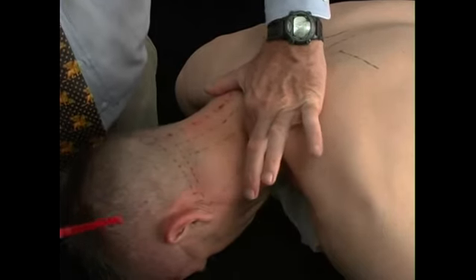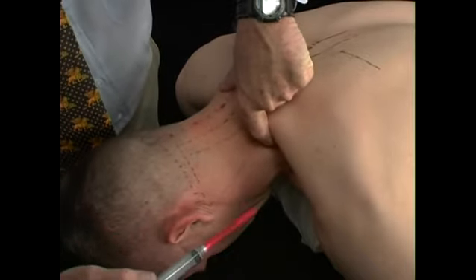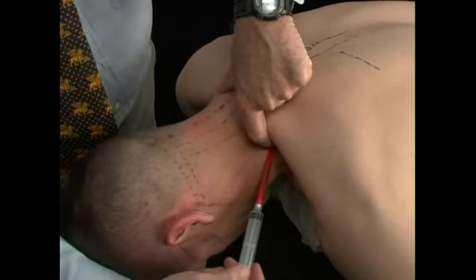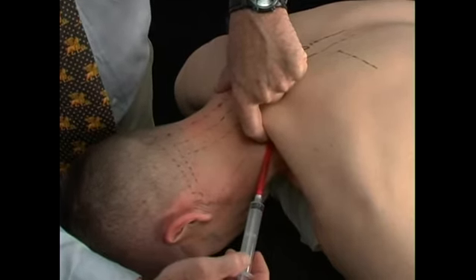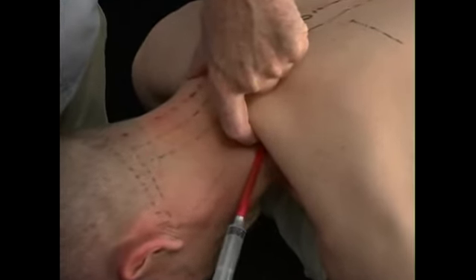There's the process right there. It's a deep structure, but you can press in quite firmly, and then with the needle aiming caudally and toward the spine, we come backwards and upwards, just very superficially, onto that tip of the transverse process of C7.